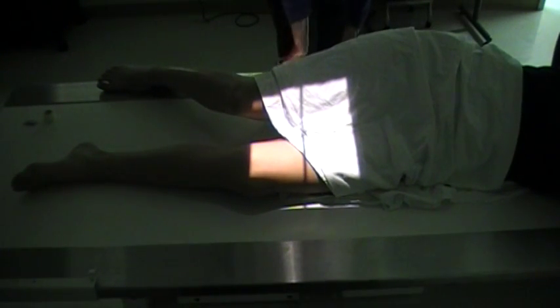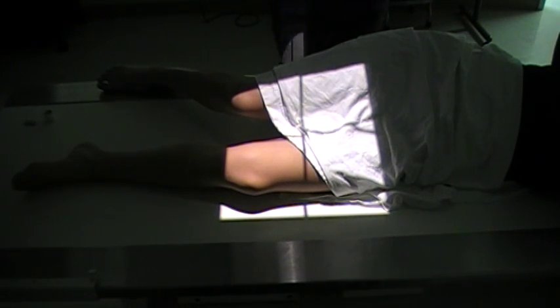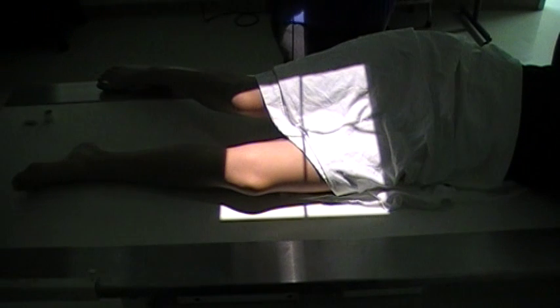And with this we'll go with our 14 by 17. And you can place your marker directly on the IR, and since we're doing the left femur, I have my left marker on the IR.